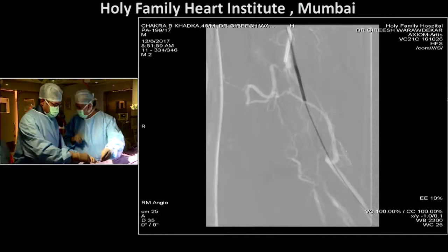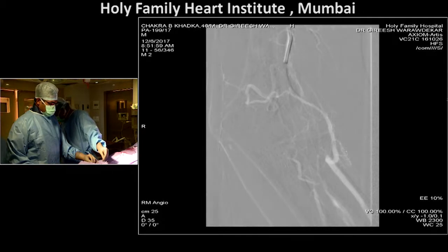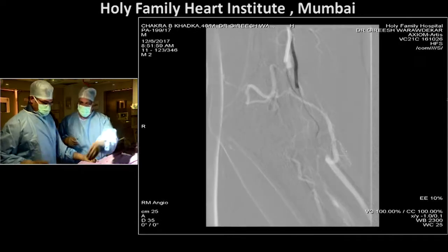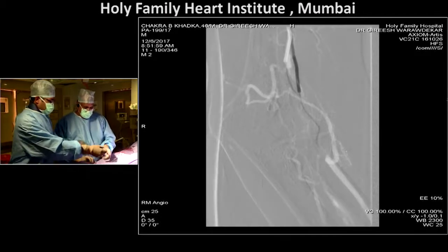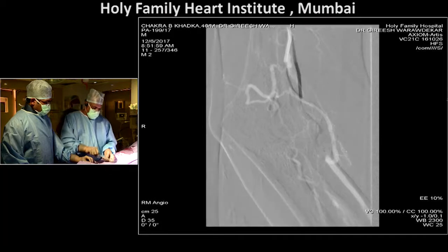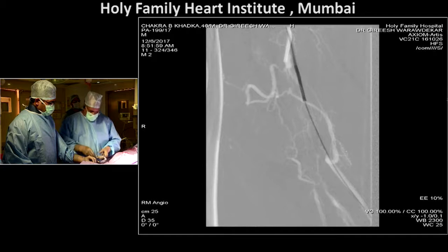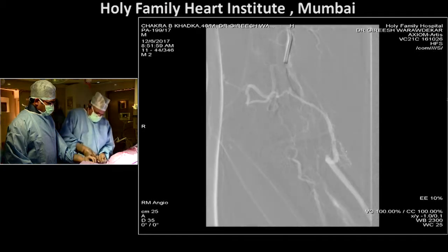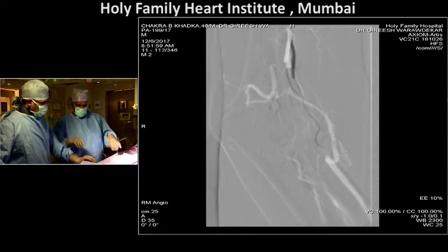If you weren't able to cross, would you have considered going retrograde as well, Girish? Yeah. That was going to be my next step. But the problem was I was a little skeptical of doing that. Probably a roadmap would have been a good choice, or an ultrasound could have helped us come retrograde and use the pedal puncture set, or the mini sets that we have now, which will take a 0.014 wire across.